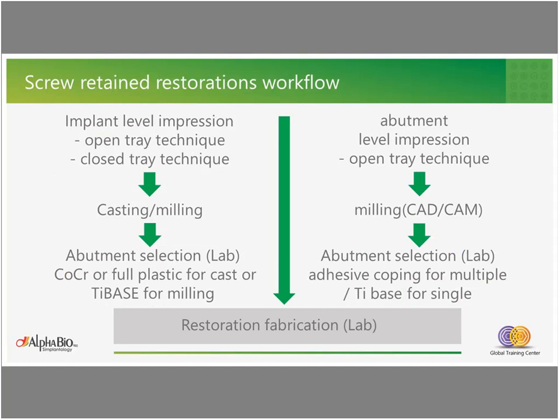On the other hand, we can make the whole process of screw-retained restoration at the abutment level. So we connect the multi-unit abutment, which is the platform shifting from internal to external connection, and then we take the impression at the abutment level. The multi-unit abutment actually makes the internal connection external, which is much easier for a pathway of insertion of multiple units, and it can also raise the level of connection between the abutment and restoration to a level that we can maintain, and we can make a good support for the whole work, and make it much easier to clean and to maintain after the finishing of the work.